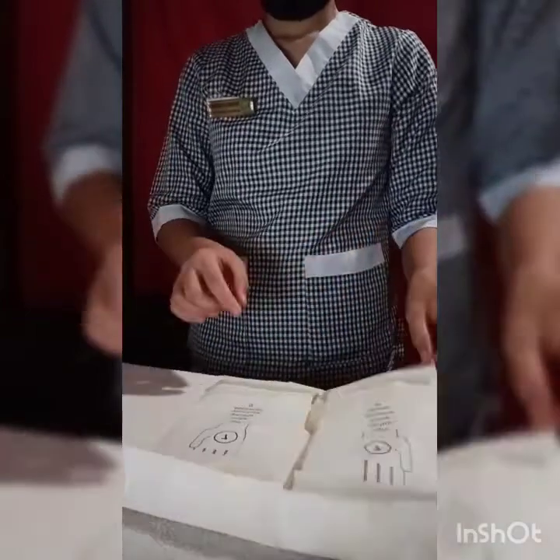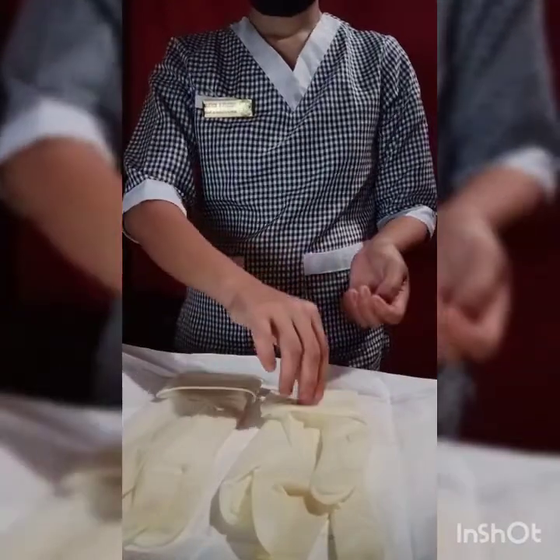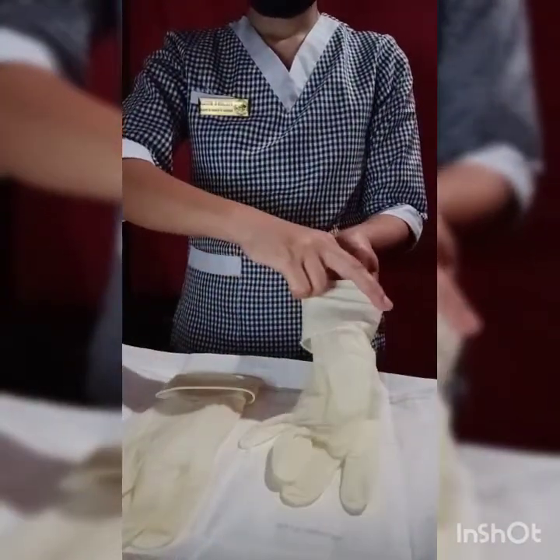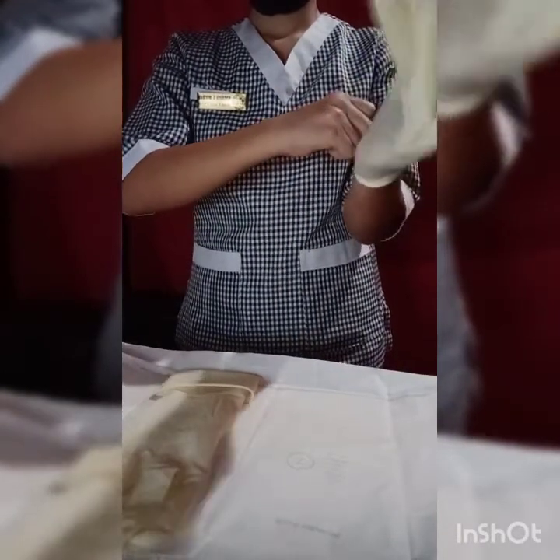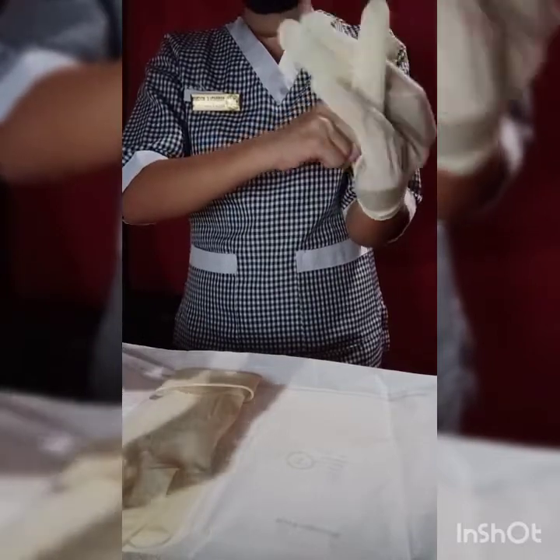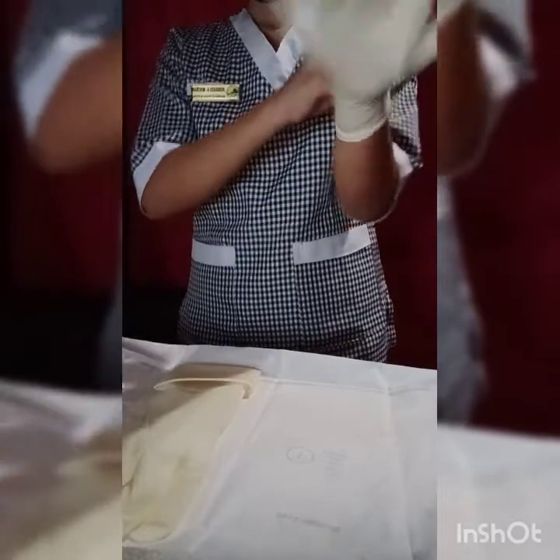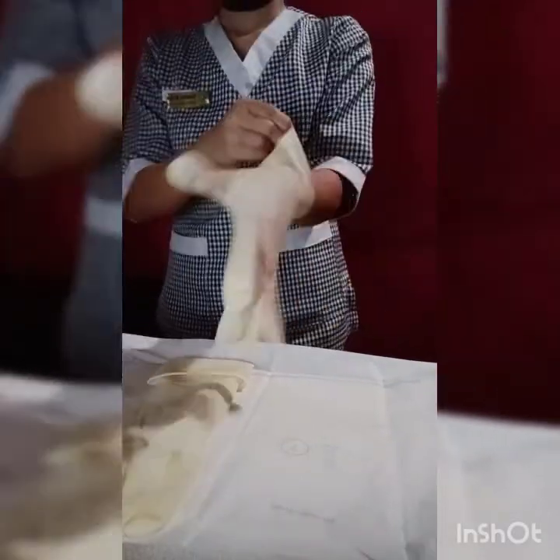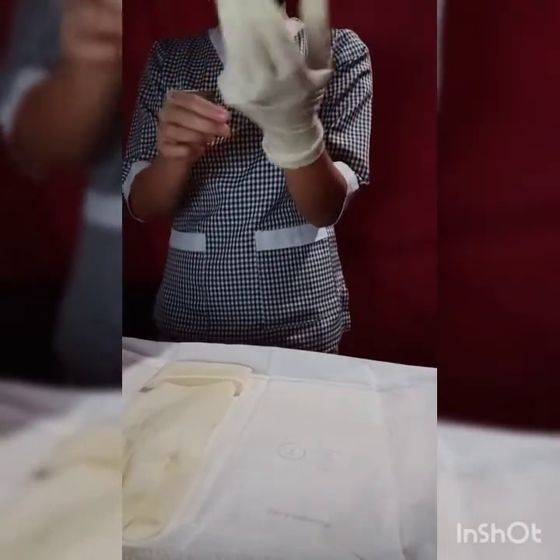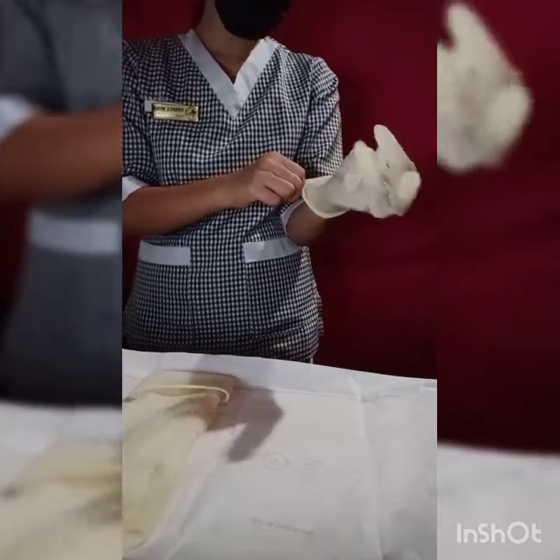So let's now do open gloving. First, put the first glove on the dominant hand. If the gloves are packed lying side by side, grasp the glove for the dominant hand by its folded cuff edge with the thumb and first finger of the non-dominant hand. Then touch only the inside of the cuff so that you will not be contaminated. Or if the gloves are packed one on top of the other, grasp the cuff of the top glove as above using the opposite hand.